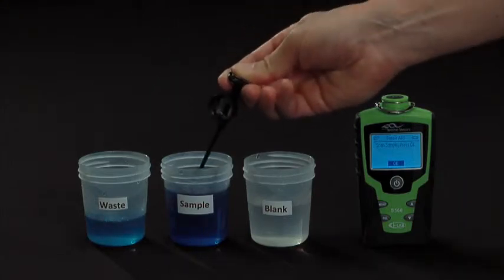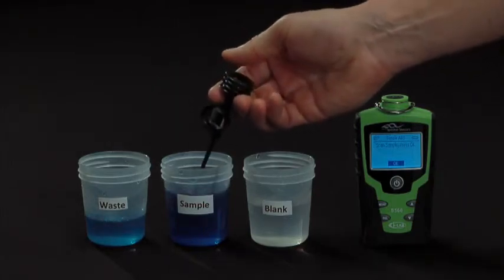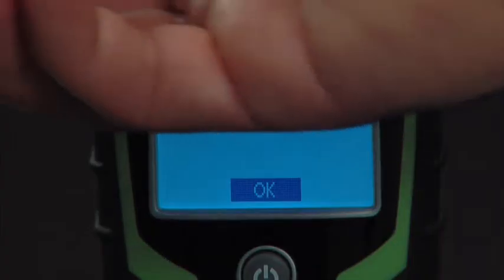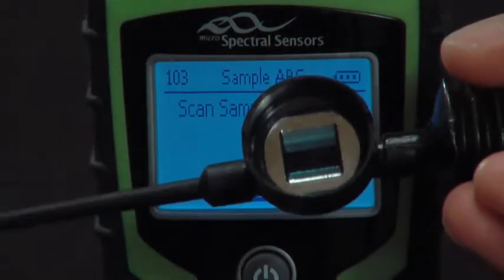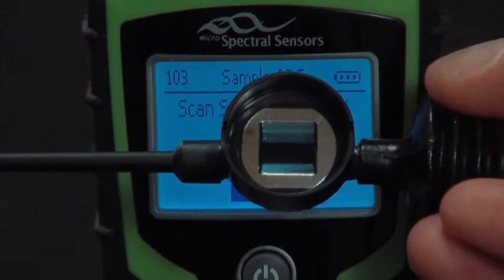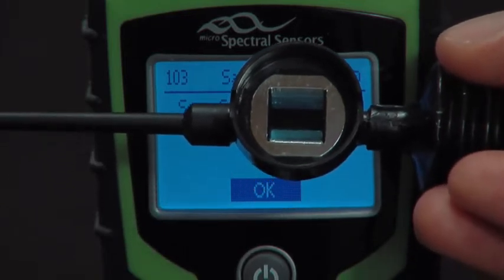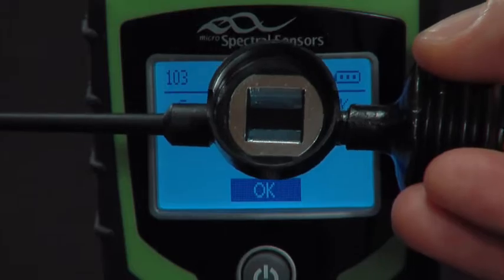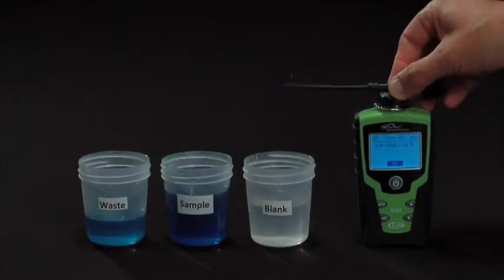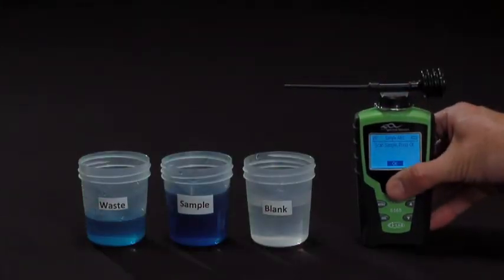We'll then redraw the sample into the Samplet, again using the technique of three-quarters of a bulb press and slowly allowing the sample to draw into the Samplet. We can then look in the chamber and verify that no bubble has formed, then attach the Samplet to the top of the iLab and press the center button to scan the sample.